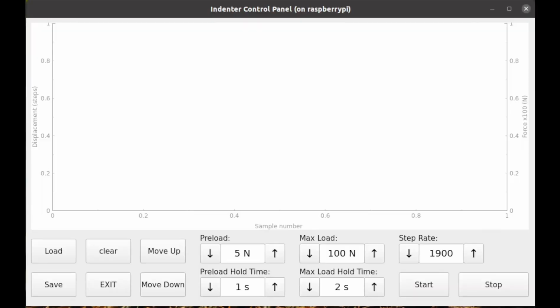Now we're going to move on to the demo portion of our presentation. This here is the indenter control panel. Typically this shows on the Raspberry Pi touchscreen, but for ease of recording this presentation, I have it showing on my laptop.